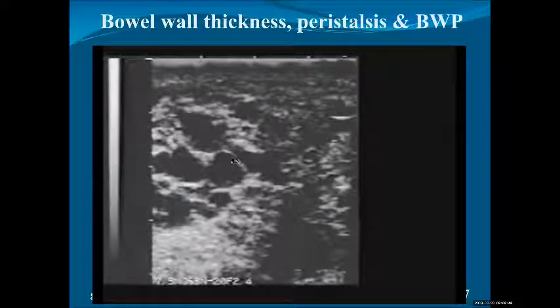And if you feel that there is thinness, probably keep the bowel moving to see if this is some kind of artifact or a real change in the bowel wall. And always, as I say, if you see thinness or thickness, don't take it alone. Take it with other features, because most of the time, if the bowel wall is moving and there is thinness or thickness, then probably either this is an artifact or not correct sectioning of the bowel by the ultrasound.